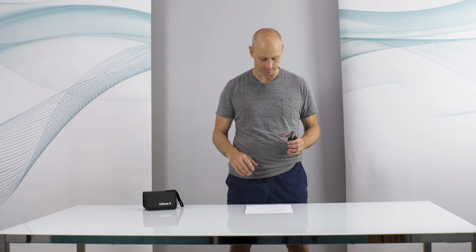Next, we're going to talk about electrode placement. Electrode placement is a little bit of an art and science. Typically what you want to do is follow a few principles on how to set those electrodes up on the body, and then from there you want to do a little bit of experimentation. Just like with a TENS device, you're going to start with settings, but from there you're going to adjust your settings incrementally to figure out what setting works for you.